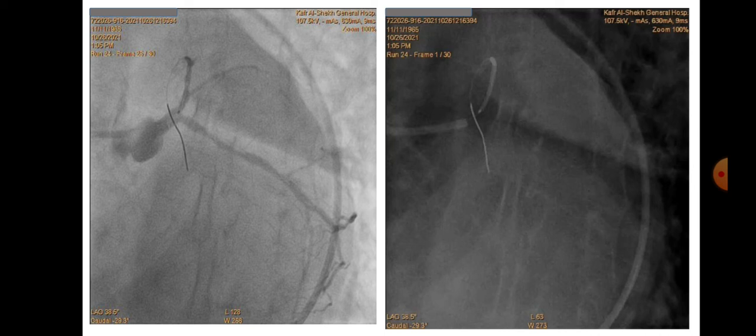With this technique, I managed to do it precisely in the ostial without needing to do the Szabo technique. As we all know, with ostial LAD disease there is no way to cross over to the left main, but actually, as you see here, the left main is healthy, and I didn't need to put a stent in it. The issue here was to accurately and precisely put a stent in the proximal LAD without approaching the left main.